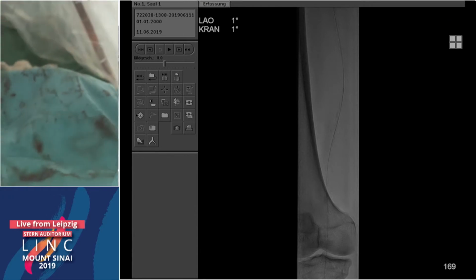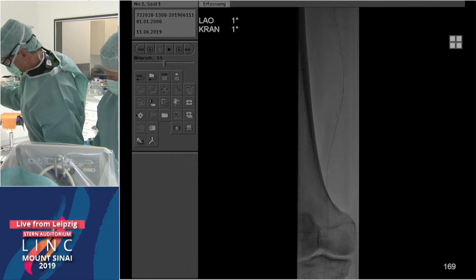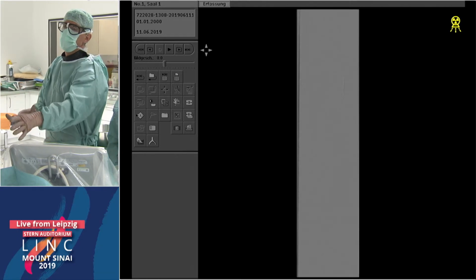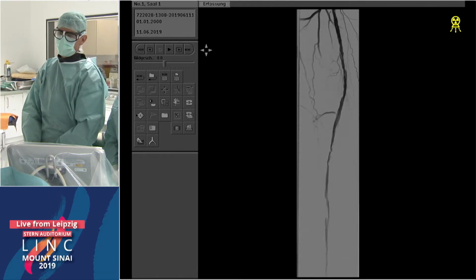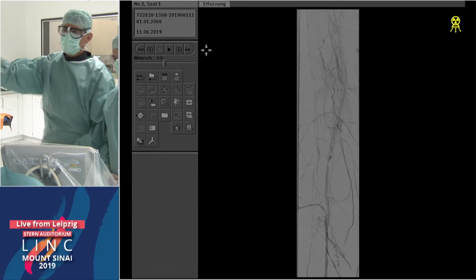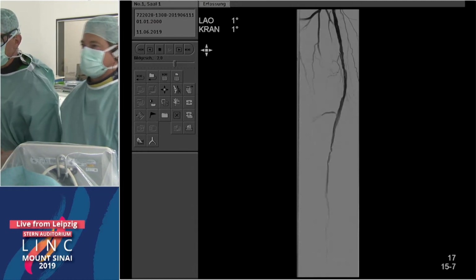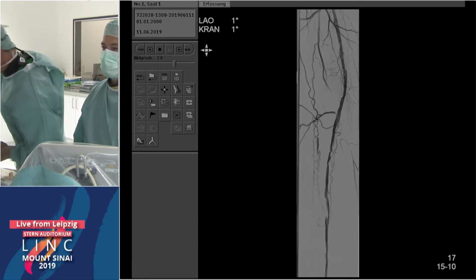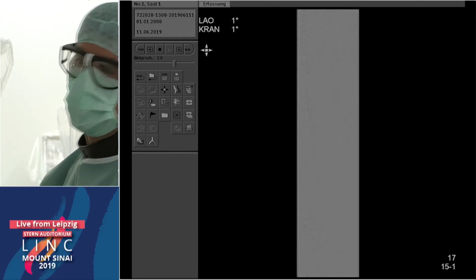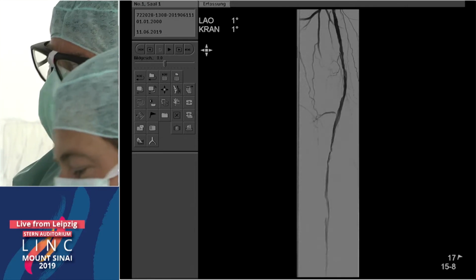So, Andre, I think we have some technical issues which we may want to take a few minutes to solve with the transmission. Okay, now we see an angiogram. Yeah, an angiogram which doesn't make me really happy. So, what are your suggestions? Can you hear us? Yes.